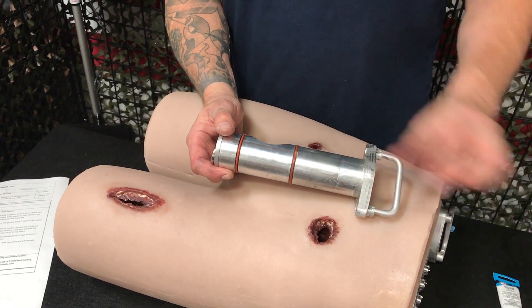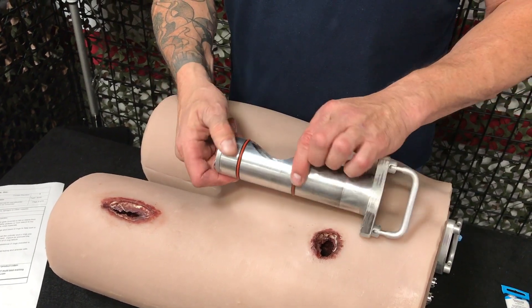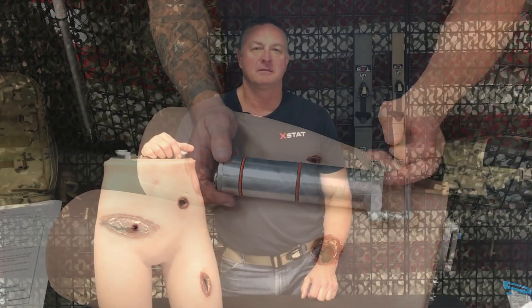Failure to lubricate the cylinder will increase the risk of o-ring failure. If an o-ring breaks, there are additional o-rings included in the storage compartment. For more information, go to revmedics.com and check us out on social media.